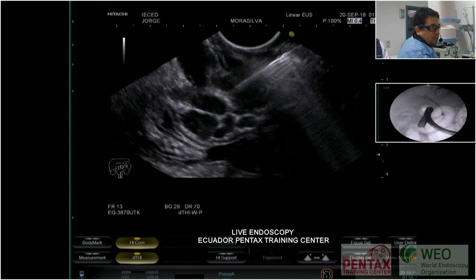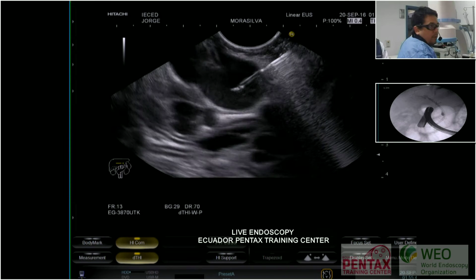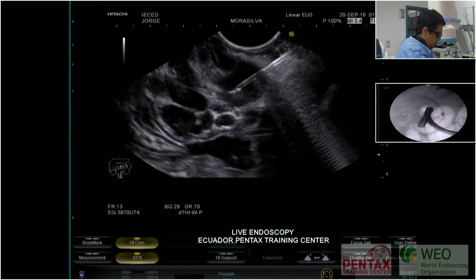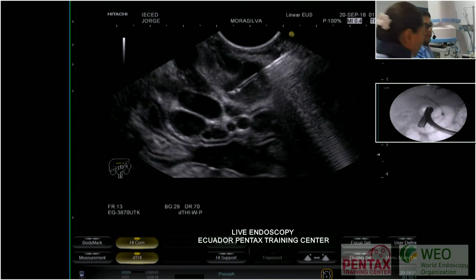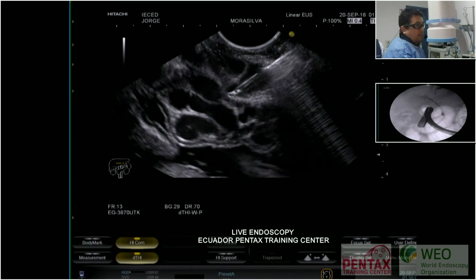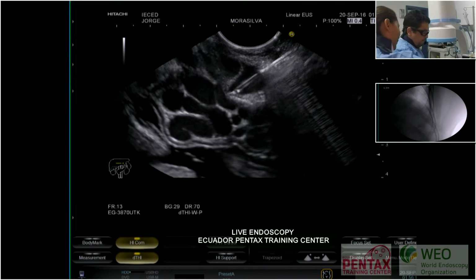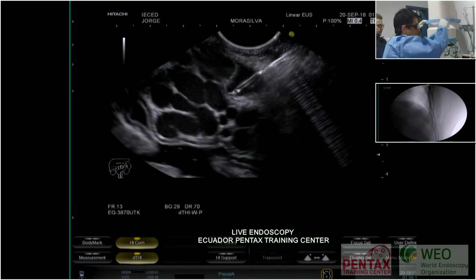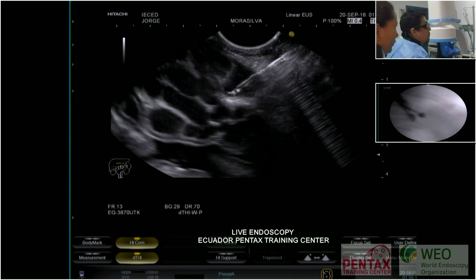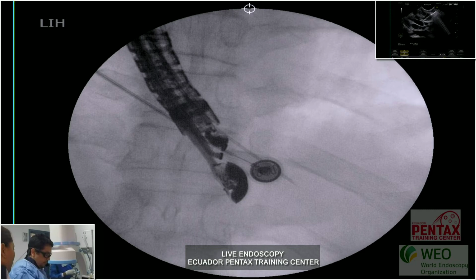We need to be sure that we are inside the vessel, okay? So here I am sure that I am inside the vessel. Okay, puedes retirar por favor. So I will perform an aspiration, and we can also see by fluoroscopy where the tip of our needle is. Okay, dame agua, por favor. Un momento. So you can see we are exactly in the fundic area with our needle.